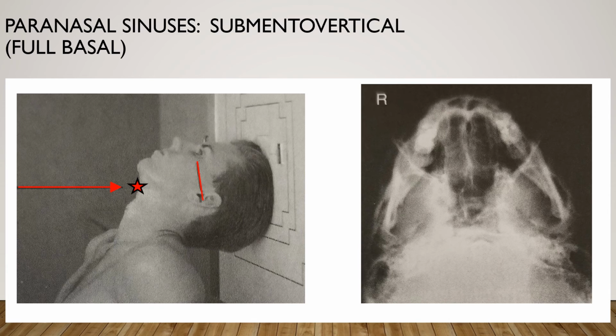We're looking at the X-ray. We have an unobstructed view of the sphenoid, maxillary, and ethmoid sinuses. Mandibular condyles are projected anterior to the petrous bone. There's no rotation or tilt. You have symmetry of the petrous pyramids and equal distance between the mandibular border and lateral sinus. Optimal density and brightness and contrast to visualize the paranasal sinuses. Sharp, bony margins with soft tissue detail and no motion.